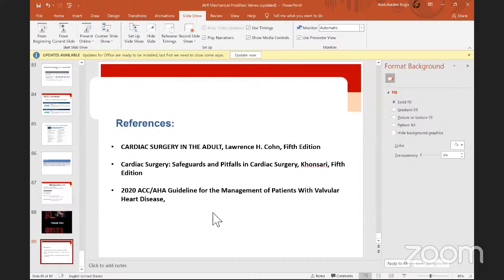But having said that, you need to make sure that you have good aortic tissue, so that when you do your suture it doesn't just tear apart. If you do want to expand your incision, or you are limited with that option and want to use it, yes, it's a valid thing. But as I mentioned, we have multiple options. We can explore, we can enlarge the root, we can replace the whole root as another option. And tilting the valve is still a valid option, but you need to know how to do it. That's a fact.